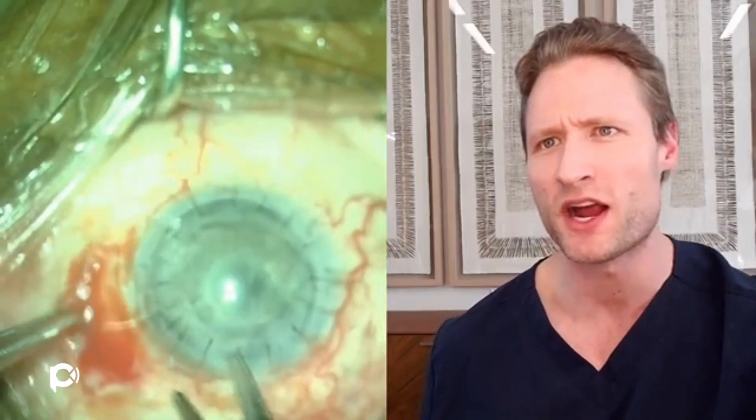The back story is that this is an eye with intractable malignant glaucoma from aqueous misdirection. You'll notice this eye has got an oversized penetrating graft, and there is this necrotic, mottled-appearing iris which is just behind the corneal endothelium. The anterior chamber is only a slit, almost non-existent, because this eye has had so much surgery and inflammation — between the penetrating keratoplasty and multiple subsequent glaucoma surgeries, including a diode laser, a trabeculectomy, and a trab revision. The eye has been inflamed, is scarred, and the anterior chamber has shallowed and narrowed.